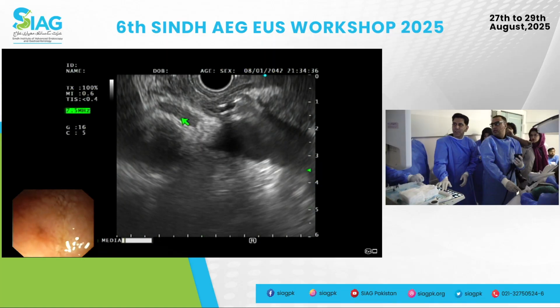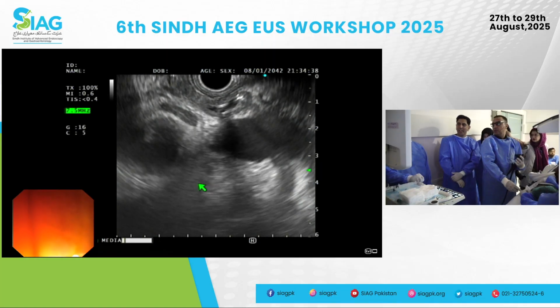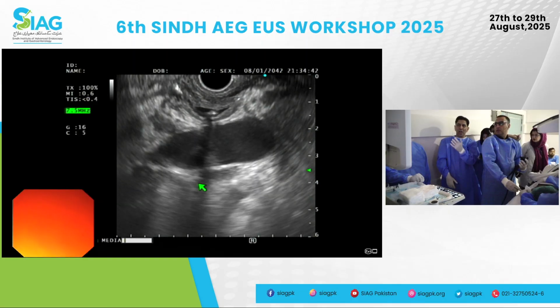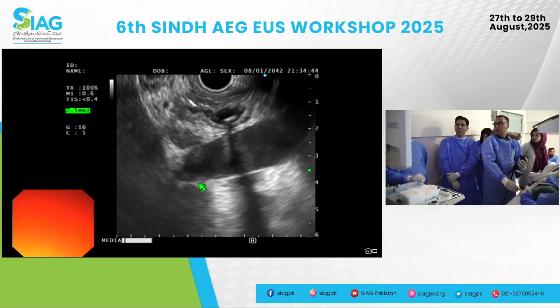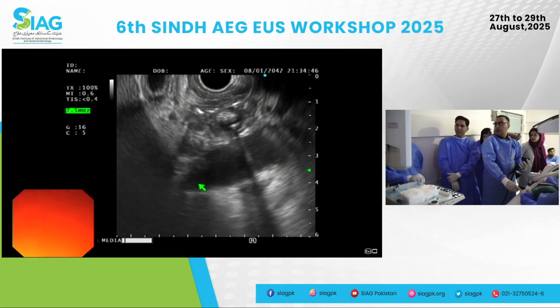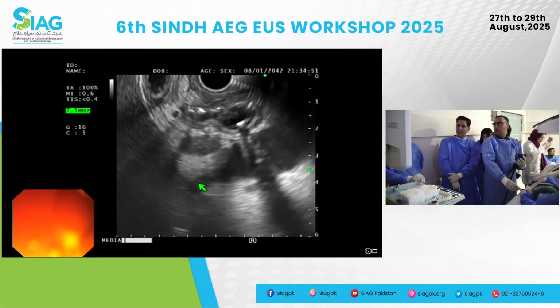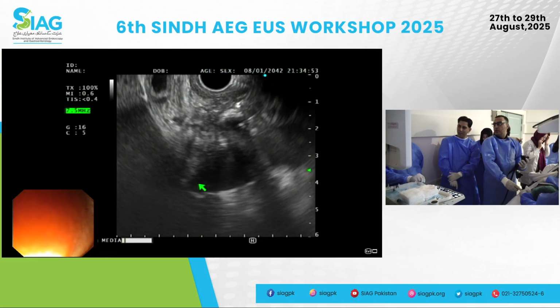Now we are moving anti-clockwise, and a small lymph node. So with anti-clockwise movements. Good, good, good. Keep going. Make sure there's no pressure on the node. So relax your tip up. Good, excellent, good.